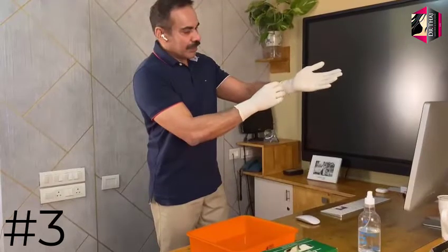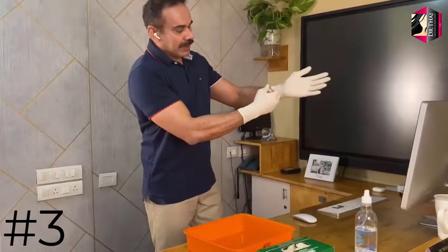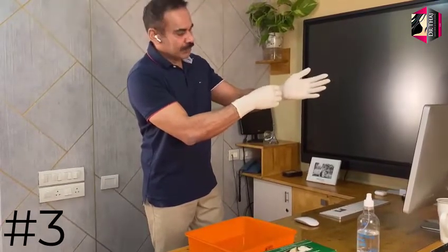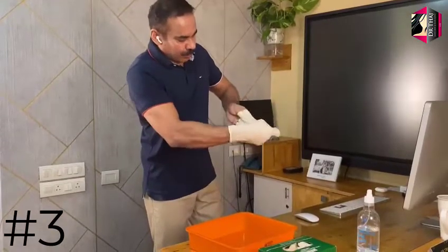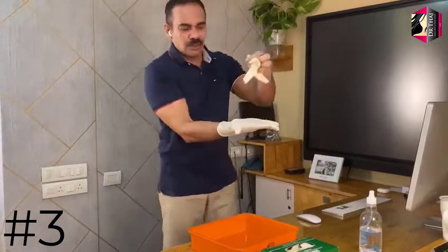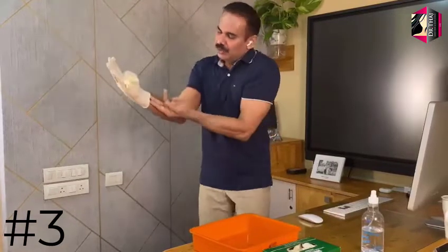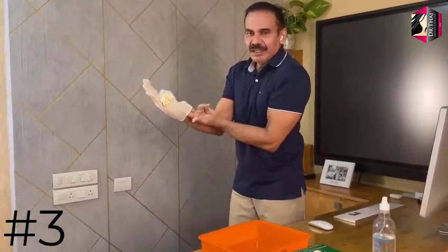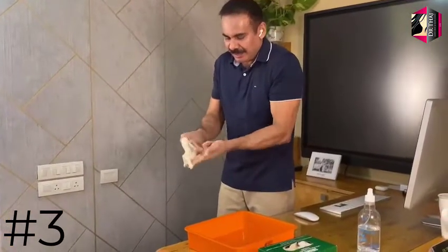First, remove the left glove with the right hand at the edge of the glove. Don't touch the skin or the inside of the glove. Now put it on the other gloved hand. Slide your fingers in — don't touch the outer surface of the glove — and slide it through.